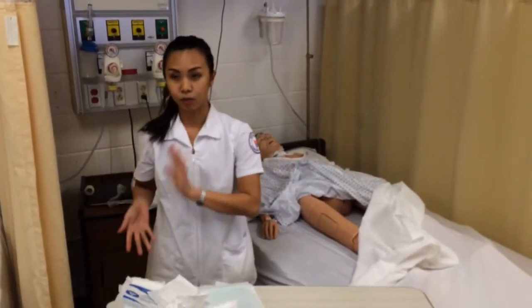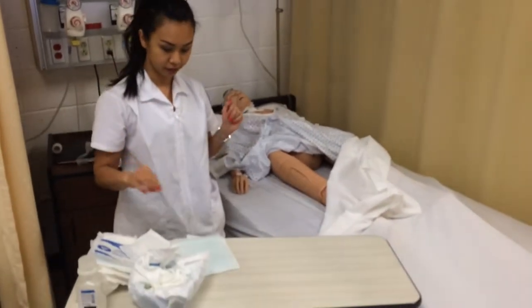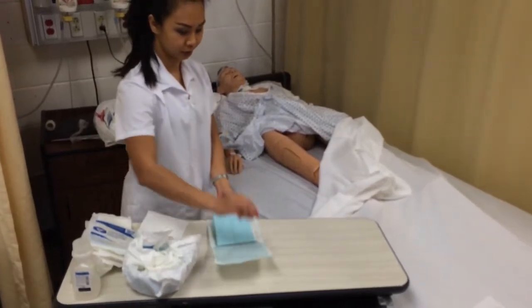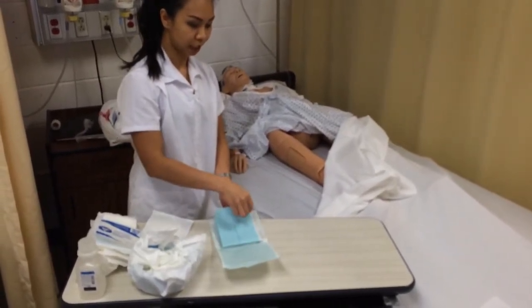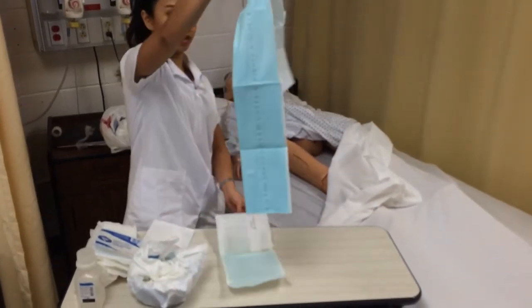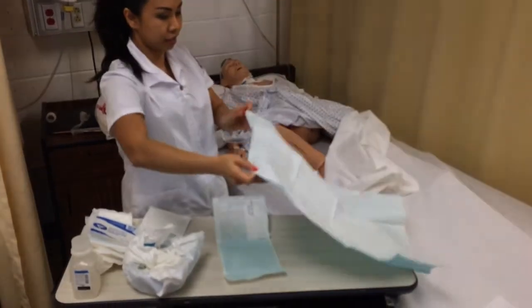After I wash my hands, I am going to set up the sterile area. I start with opening the drape away from myself, grabbing the 1-inch border on the side, opening it up, and placing it on the table.